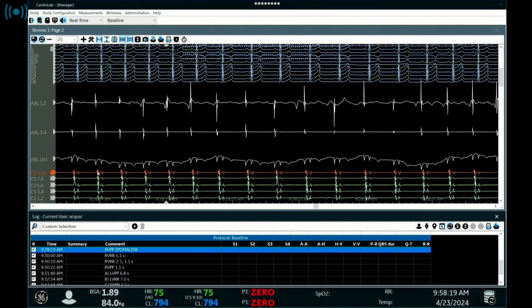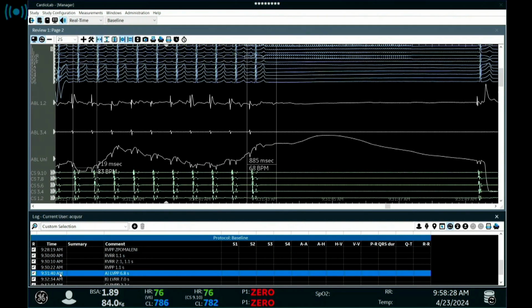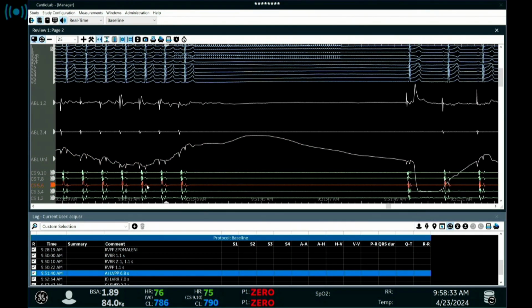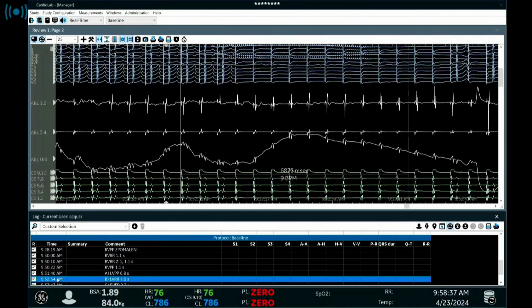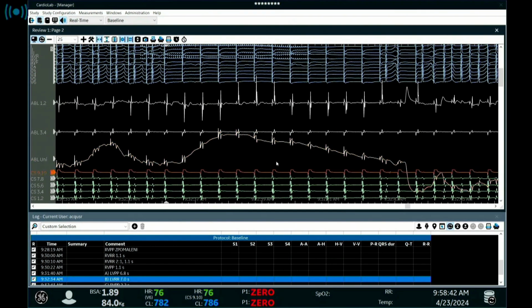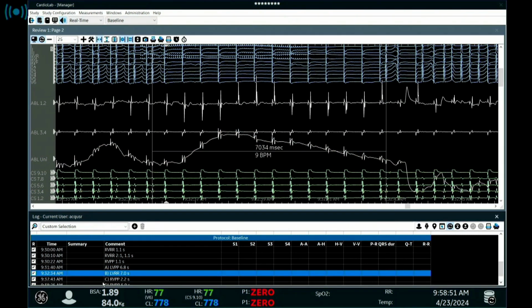That was atypical because we also paced from the left vagal nerve. Can we show the left vagal nerve stimulation? And there was a pure, very nice sinus arrest, and also during the stimulation, there was a long AV pause. So with our approach, we were not able to make a big pause on the right side. So Roman will show you how we deal with this.